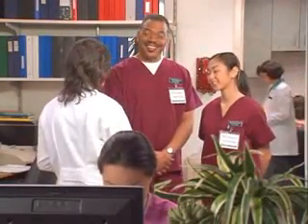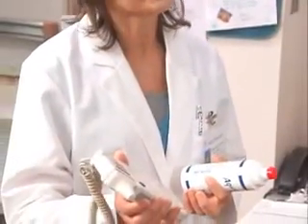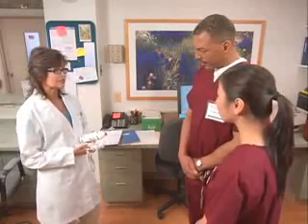All right, I want to show the two of you a little something out of the ordinary. How to assess systolic blood pressure by using a Doppler ultrasound. It's not something that you would have to do very often, so I've asked a patient to allow us to practice with it. Good. I could use some practice. Yeah, I'm not that familiar with it either.